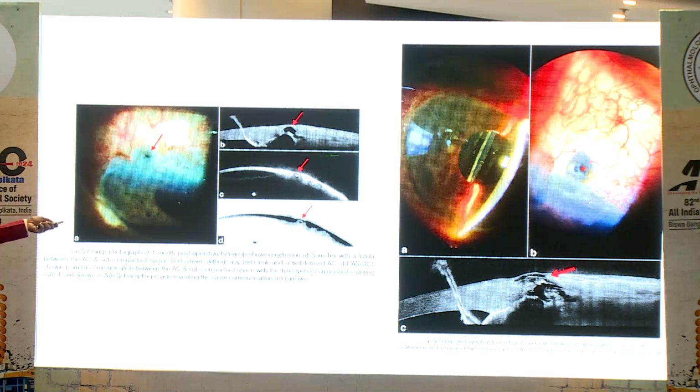And you can see that this is again the patient. Recently we are following up the patient very closely. We did think of a fistulectomy, but we didn't do it because when the patient came earlier, this was a fistula and we didn't do close monitoring, but see how the fistula has become now. With anterior segment imaging, we are seeing the fibrosis. The fistula was like this. Now it is undergoing fibrosis, so I don't want to touch it.